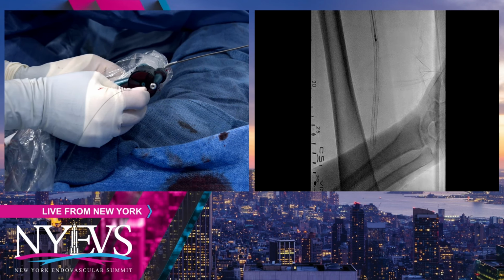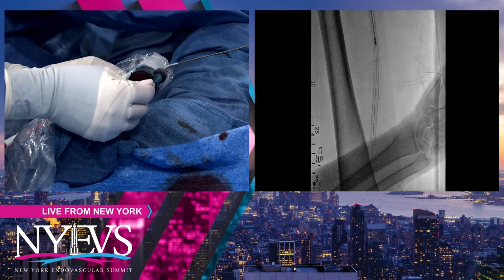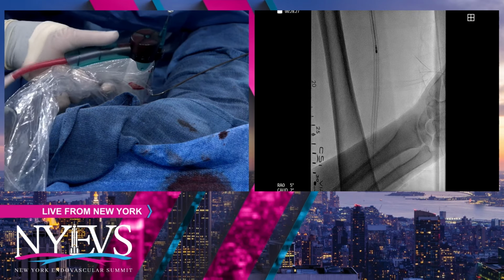Get a predilatation balloon. Can you hear them? We can't hear them. Are they talking? Five Armada. We're still here, guys.